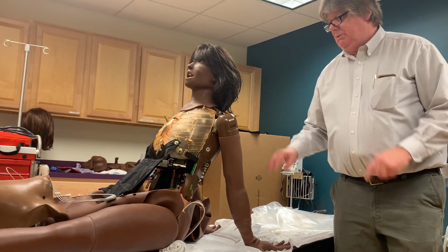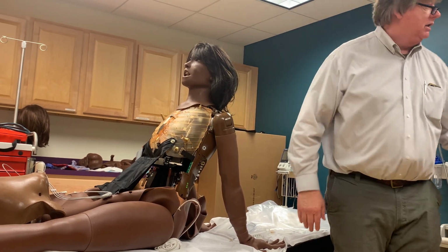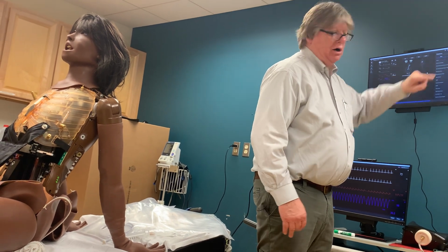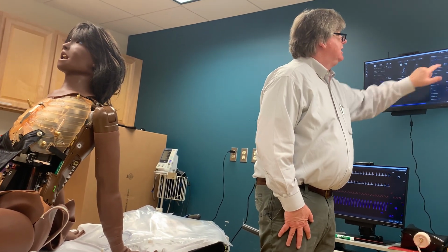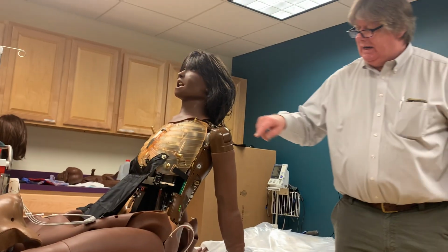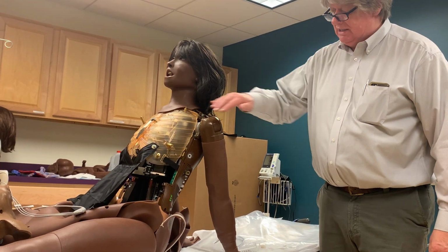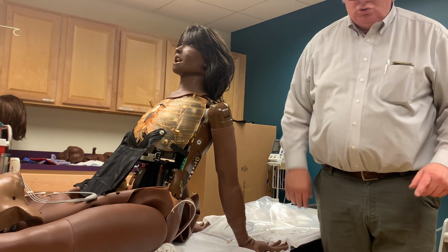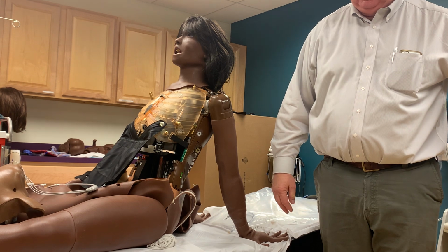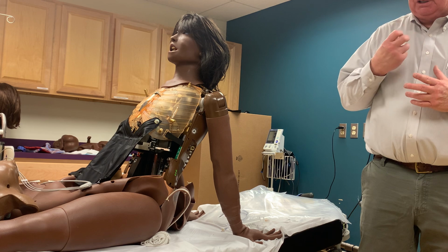Similarly, if you wanted to simulate the fact that she was on a ventilator or there was an obstruction on this side, in the software where it gets to up top, it has bronchial occlusion. I can make it like she is occluded on the left side. There is a mucus plug there. And now I have again the paradoxical movement here, because this side isn't moving. You can't do this stuff on Juno, okay, because Juno doesn't do this. Only time Juno's chest will rise is if you're doing bag valve mask.